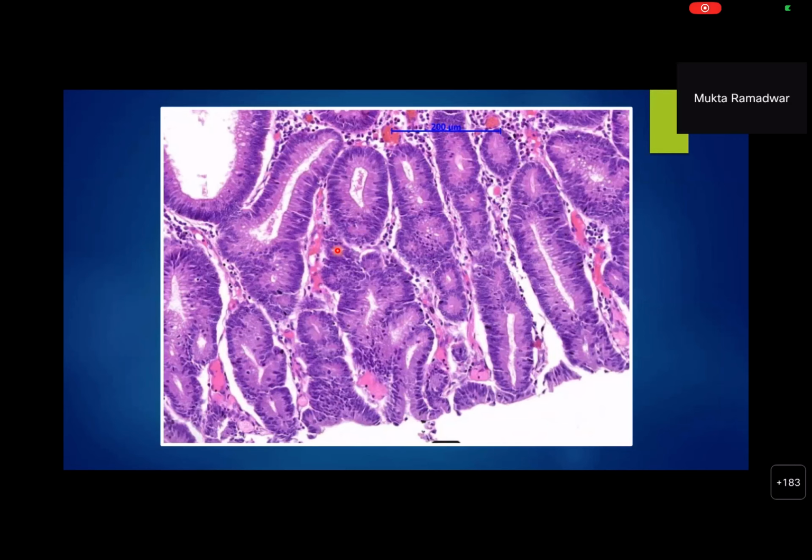Okay, can you see too many mitosis here? I cannot see. Could you see? There might be occasional mitosis, but there aren't too many of the mitosis. Yes, basal mitosis is increased, ma'am. Yes, but not very brisk mitosis.